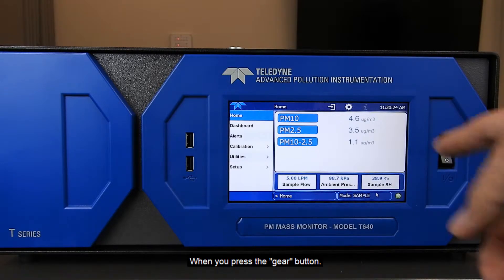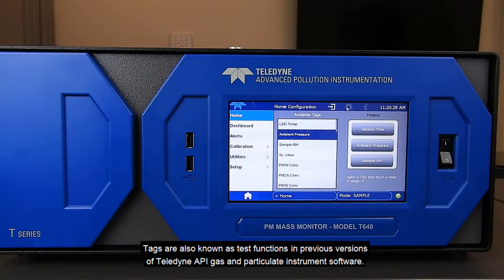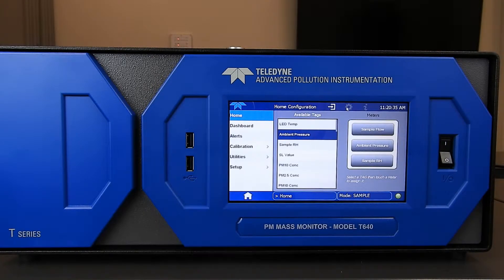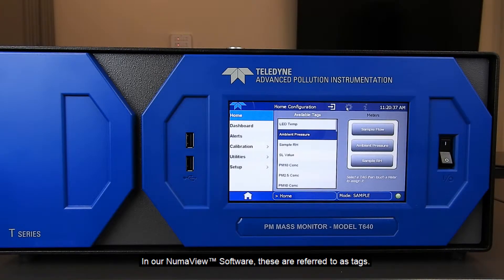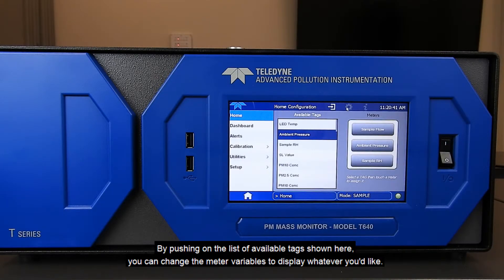When you press the gear button, the available tags are displayed. Tags are also known as test functions in previous versions of the Teledyne API gas and particulate instrument software. In Numaview, these are referred to as tags. By pushing on the list of available tags shown here, you can change the meter variables to display whatever you'd like.